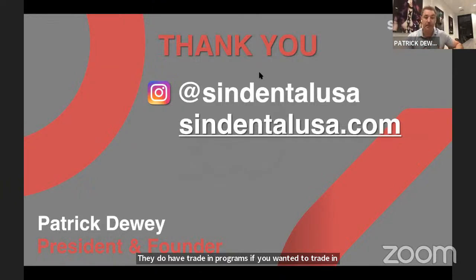The 95 is amazing for big platform prints. Like, for example, the ones that we have in the back, we print off maxillary arches with full zygomas. So when we do zygomatic hands-on workshops, we can print off a really big restoration, which is the skull. But other than that, we don't use anything other than maybe dentures with the 95.